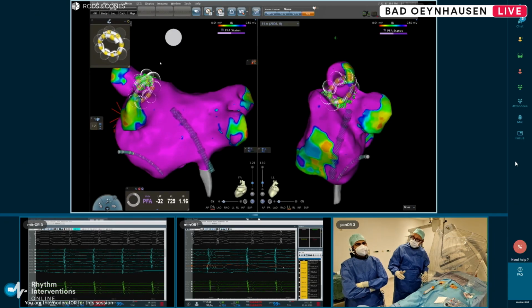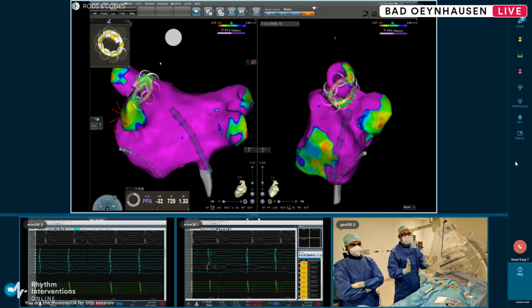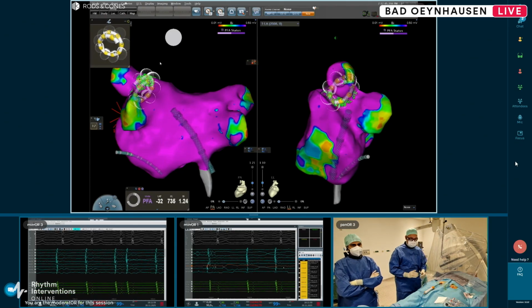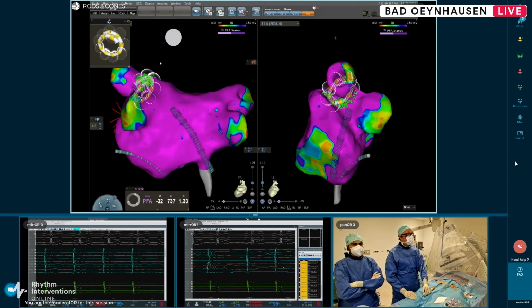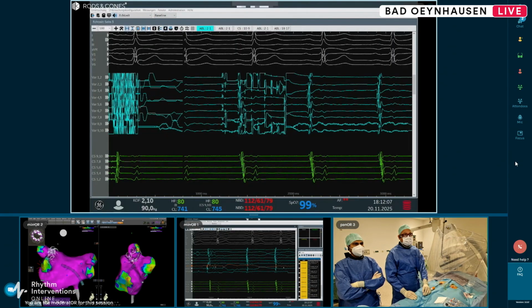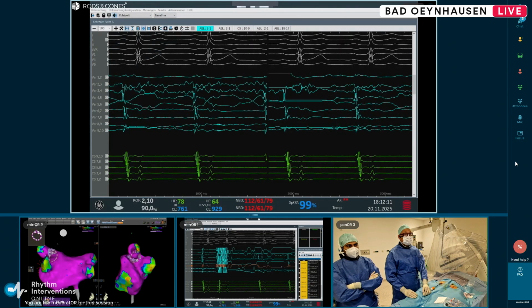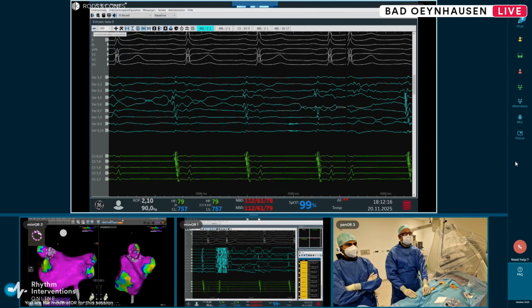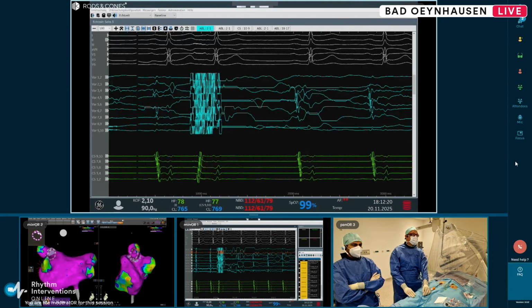And while we're doing so, before we start, please now highlight the electrograms, giving you again the opportunity to see that the signals finally disappear. And Mr. Ertem, now please give the first application. Now it's loading, you see, and look at the patient. The patient is not moving at all. You see that the main component of the signal already disappeared. We have 3 cycles. That was number 2.